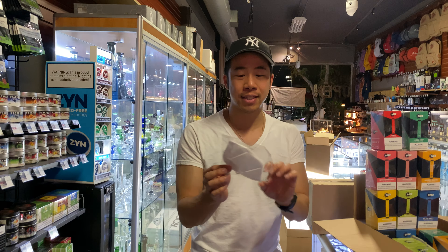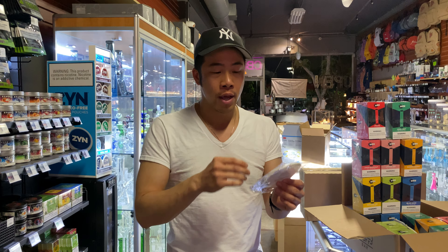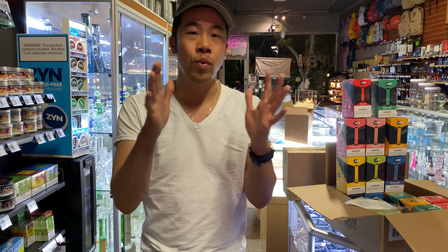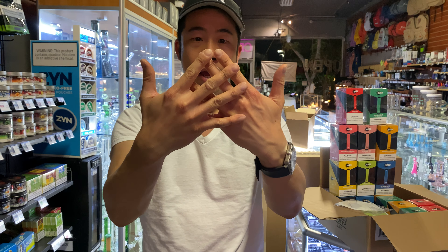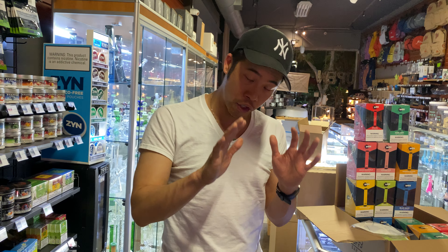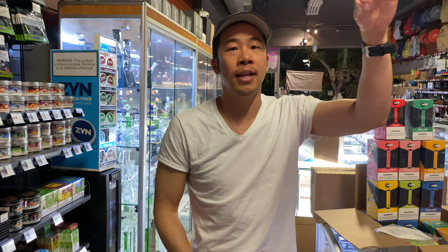One thing I wouldn't do with these masks is scrub them. Don't get a brush and scrub it, and don't put soap on it. I would just use heat and let it hang dry, because if we zoom into the mask there's mesh, and we don't want to open up the mesh and allow bigger nano-bacteria to enter the mask or the mouth. The best way is to not scrub it, shake it, or touch it too much — just make sure everything's intact, put heat on it, and let it hang dry.